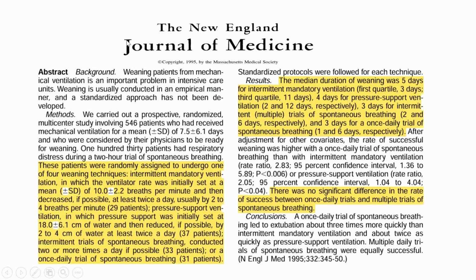And weaning also has been studied in 1995. And as you can see in the conclusion, a once daily trial of spontaneous breathing is usually used. So those of you who have a Mindray machine, you have a daily spontaneous breathing trial for a 30-minute duration. You can increase the duration of the trial every day, up to a maximum of 2 hours, maybe 120 minutes. But the main aim is to use the daily spontaneous breathing trial, with a built-in SBT mode for a Mindray machine. For a Philips machine, you can use a CPAP or pressure support ventilation mode for a patient to assess weaning. Otherwise, the use of SIMV mode or other modes for weaning is falling out of favor recently.